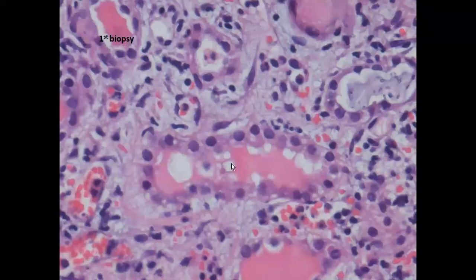This was a tubule, and you can see these are the tubular epithelial cells, and you can see one lymphocyte here. So there is evidence of mild tubulitis. In addition to that, the PTCs are congested and they are showing PTC capillaritis. You can see neutrophils and 1, 2, 3, 4 lymphocytes in the PTCs. Some of the PTCs are empty, but some are showing this. And you can also see some neutrophils and some RBCs in the interstitium.